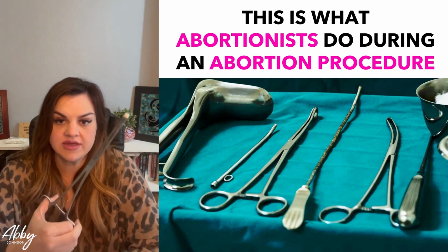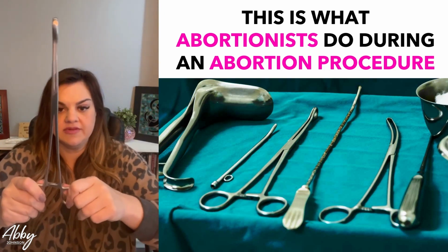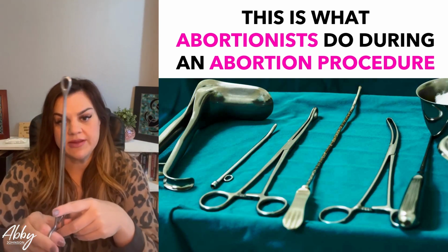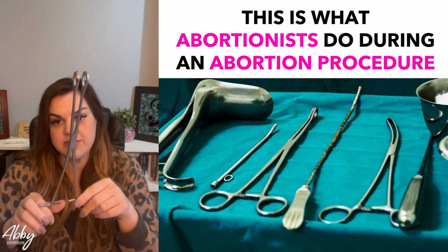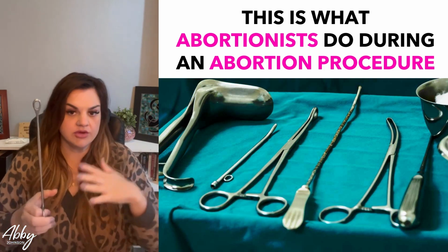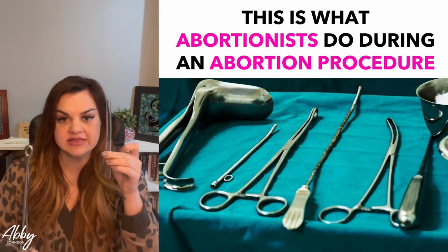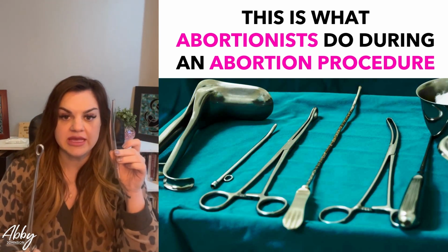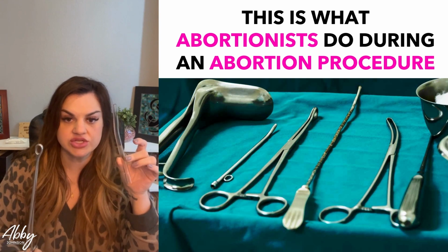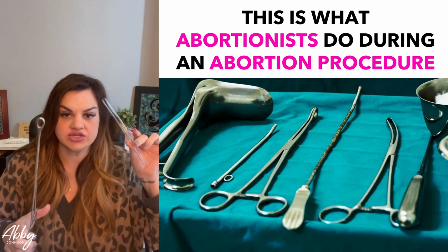And the reason I wanted to show you this is because when you click this together like that, it will not come apart. See, it won't come apart. So when they're doing a second trimester abortion, this is a similar type of instrument that they use. So a second trimester baby, 14, 15 weeks and above, is not going to fit through a suction tube like this. The baby is too big, and the baby is too well formed to fit through a suction tube. It won't come apart enough. It will not be dismembered to actually fit through a tube.